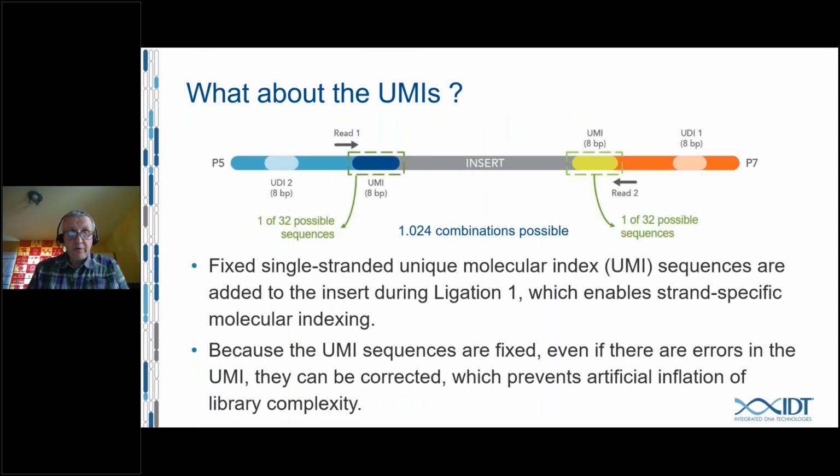A word about the molecular barcodes. Those are not random sequences. Those are really fixed sequences. They are molecular barcodes with a length of 8 nucleotides. And in the adapter pool, we are pooling 32 combinations.